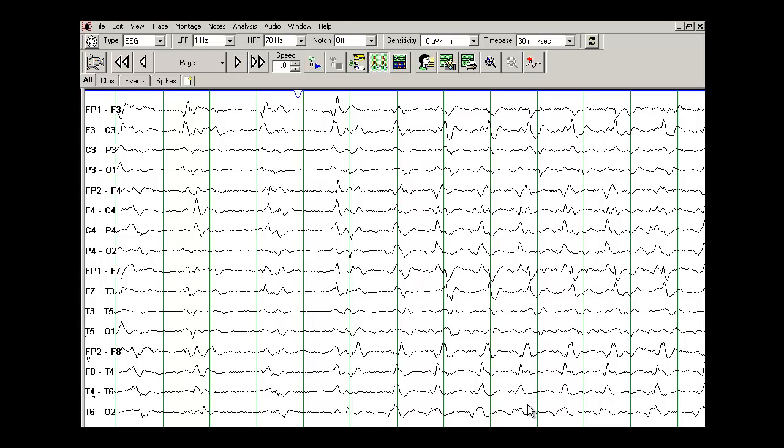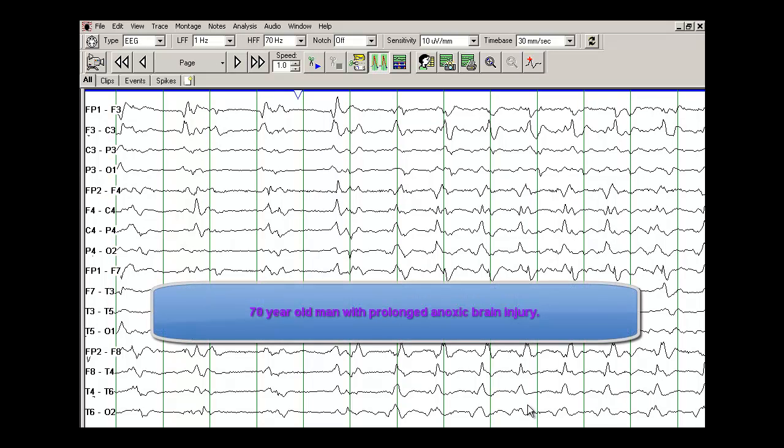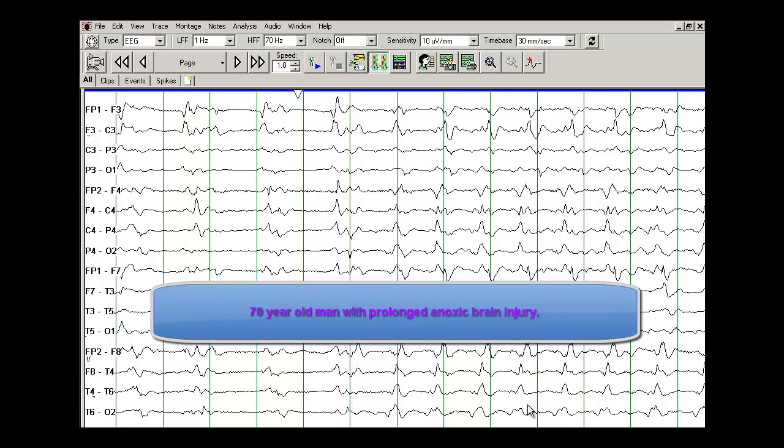This EEG was recorded from a 70-year-old man who suffered a severe and prolonged anoxic brain injury.